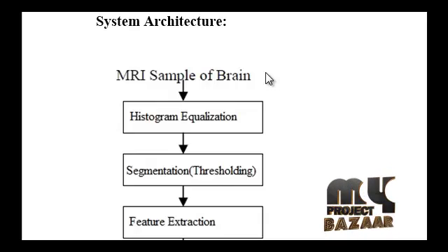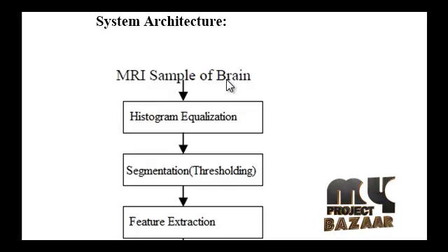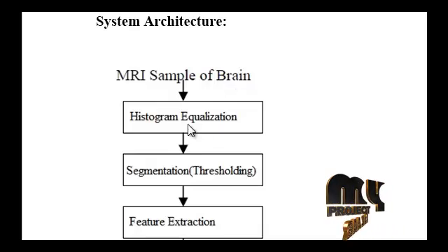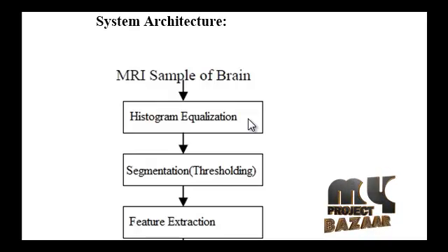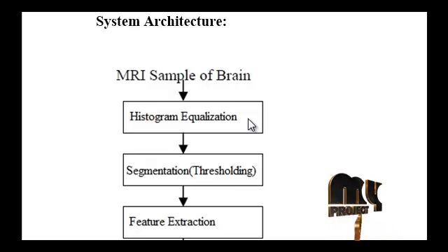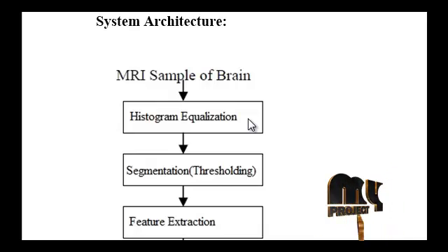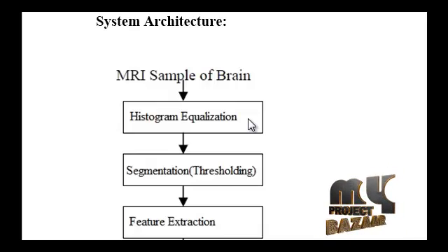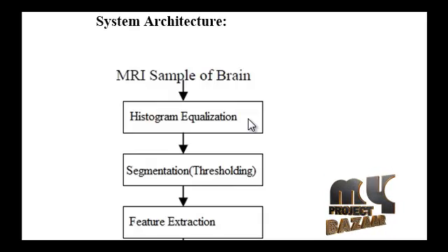First we load our input MRI brain image, then we pass the input image through histogram equalization for enhancement. Histogram equalization is a method in image processing for contrast adjustment using the image's histogram. This method usually increases the global contrast of many images, especially when the usable data is represented by close contrast values.